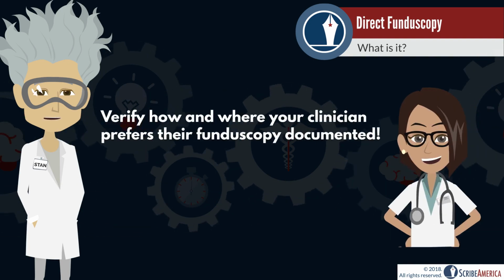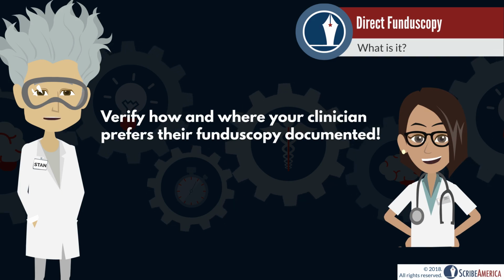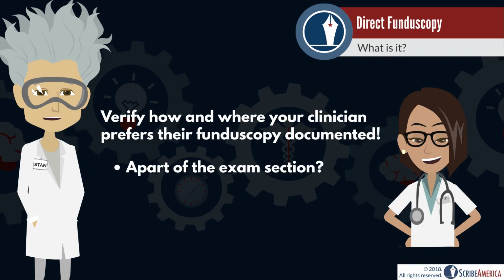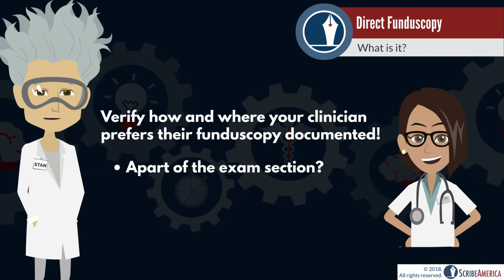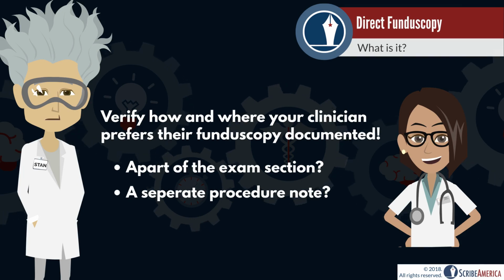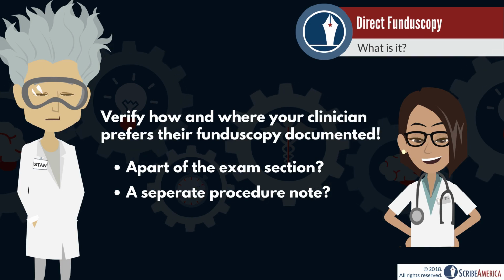Whether you're documenting a funduscopic exam for the first time or working with a new clinician, verify where and how your clinician wants this information documented. Some clinicians may ask that you only document the findings discussed in the room in the physical exam. Some may have you document a procedure note that also includes information regarding the equipment used, whether consent to dilate the pupils was obtained or necessary, the patient's position, and more.